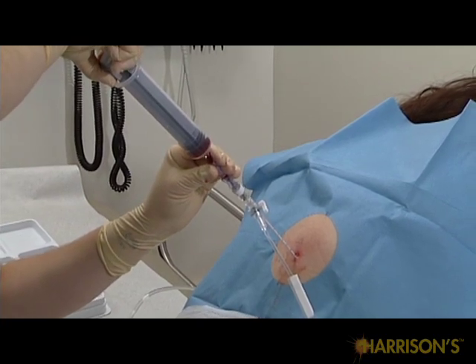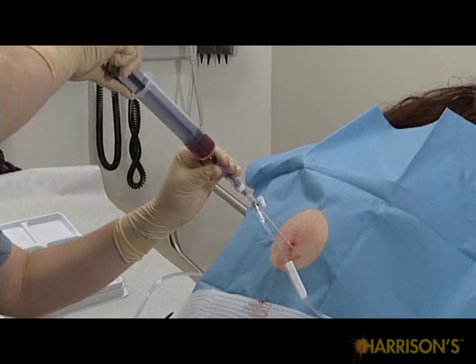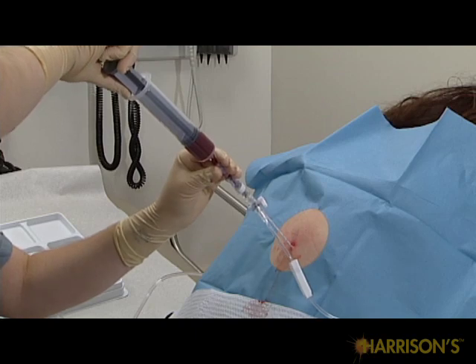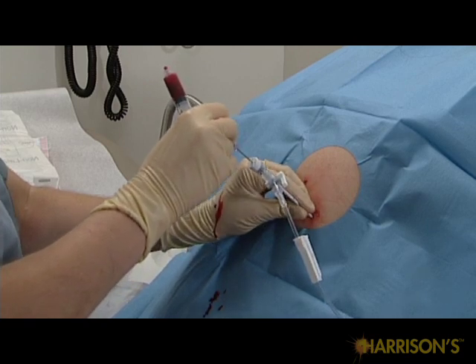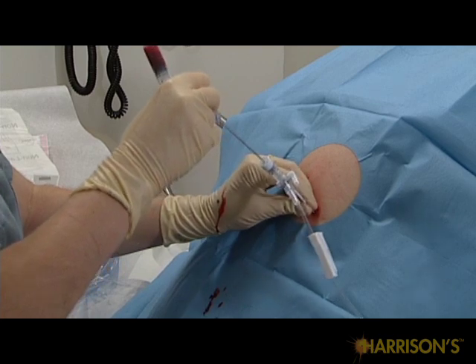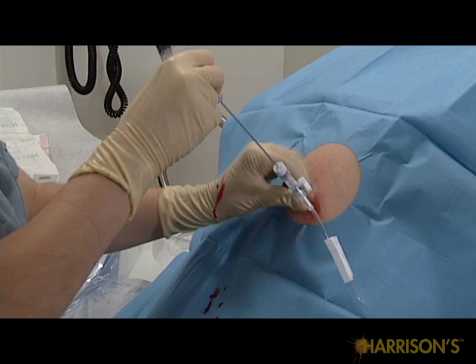Drain 30 to 60 cc's of fluid to be used for analysis. Send the collected specimens to the lab. Next, advance another 1 millimeter before pushing the catheter sheath into the pleural space. Draw the needle back as you advance the catheter.